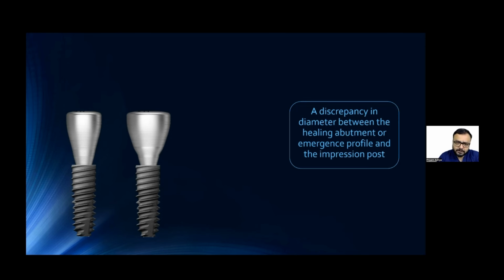The prosthetic components remain the same, which means the diameter of the channel in which the components are fitting is the same. It is the top part of the healing abutments which is changing to give you the profile that you need. So if it's a molar, maybe you're using a 7 millimeter diameter healing abutment. Now that's a big change that you're doing.